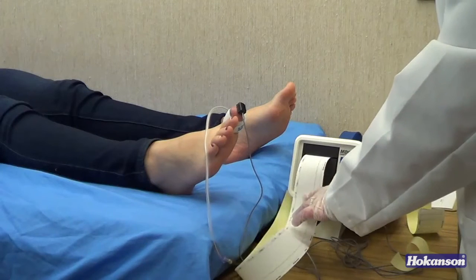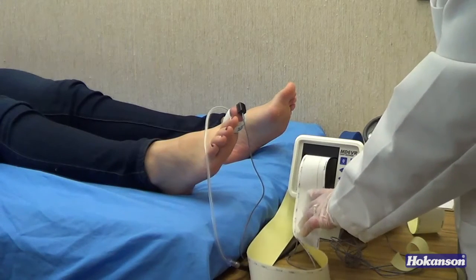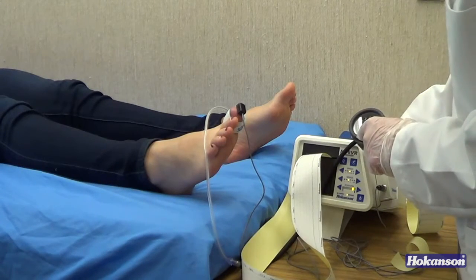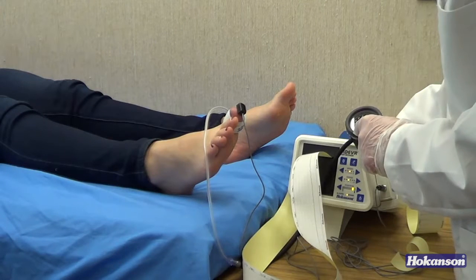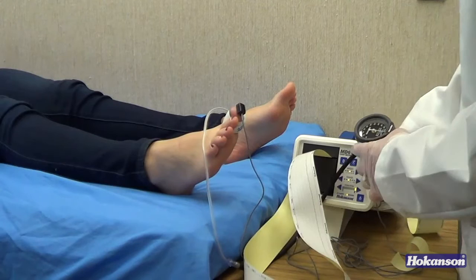There's the patient's return pulse. It's very small, but it's definitely present because it's repeated. And we read on here the corresponding pressure. It's 94 millimeters of mercury. That is the systolic blood pressure in the patient's toe.